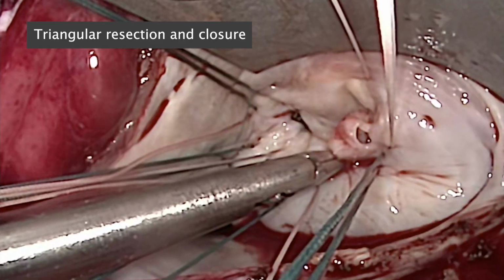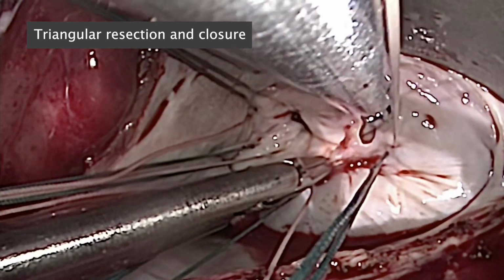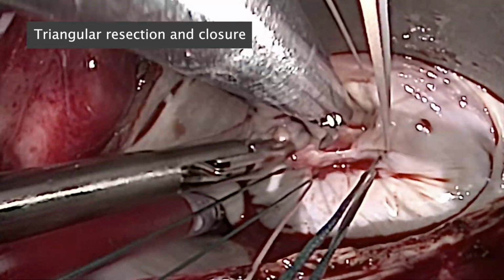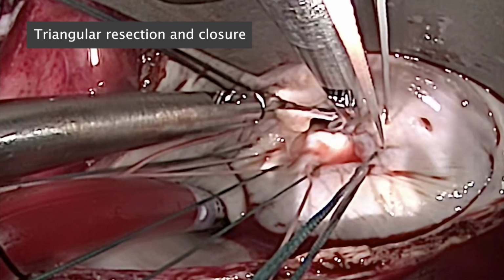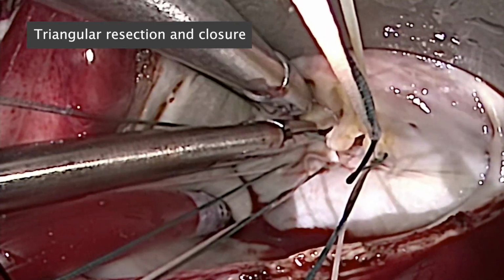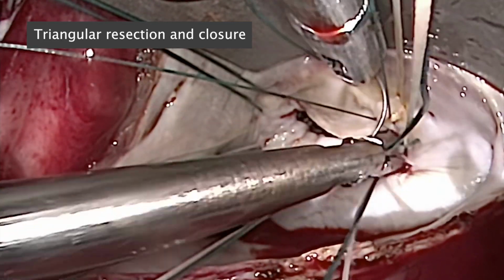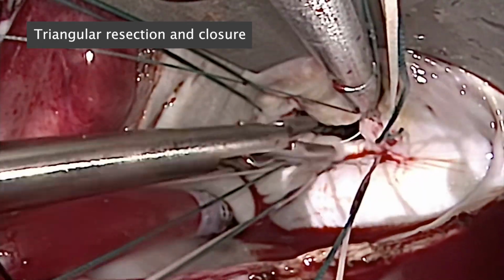We remove the devitalized tissue by performing a triangular resection, starting from within the perforation and excising all the affected tissue. Fortunately, with redundant tissue, we were able to close this primarily using a running 4-0 Ethibond suture. We are careful to imbricate the edges to create a smooth surface of coaptation.